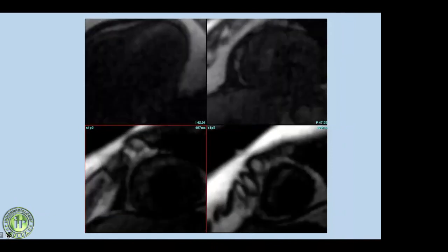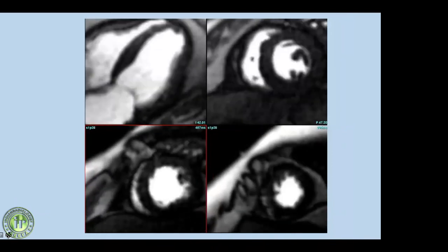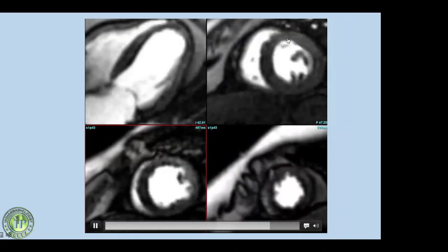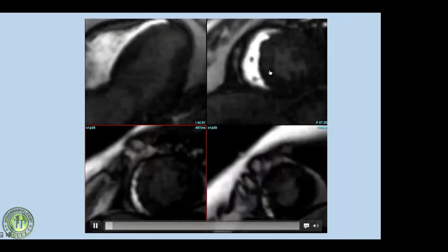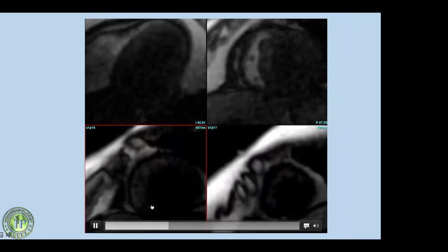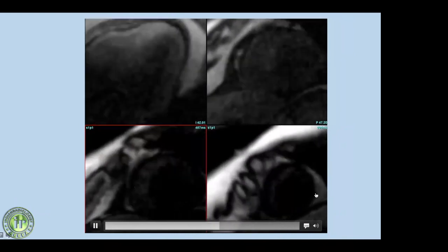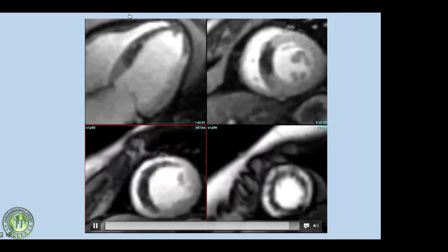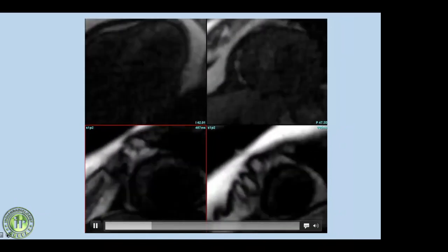A resting perfusion scan showed a perfusion defect in the interventricular septum, with basal, mid, and apical LV segments all showing a perfusion defect fitting into LAD territory.